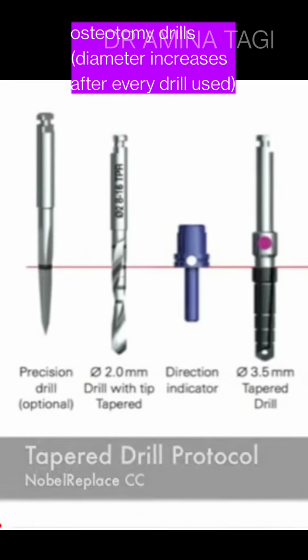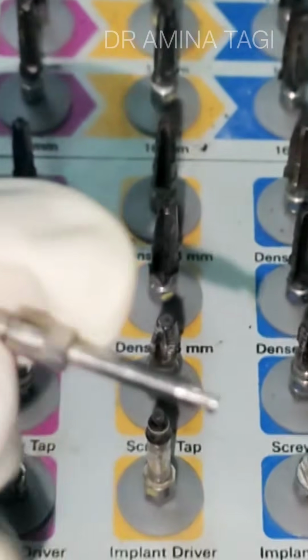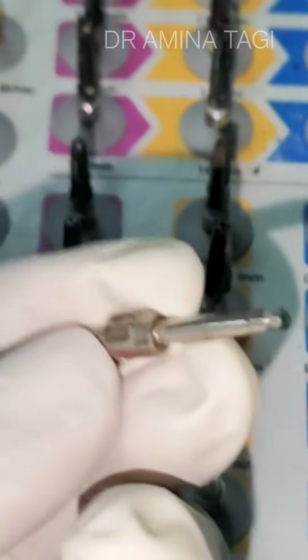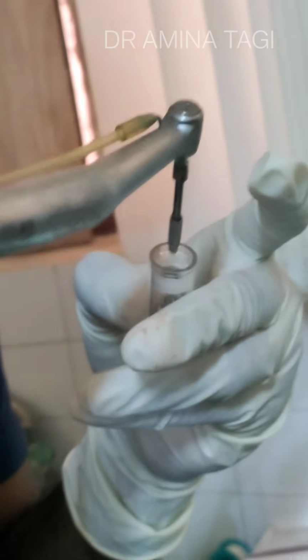So now I am done with the drilling sequence. Now I will be placing the implant finally. So this is the implant driver. We'll insert the implant driver into the handpiece, and then we will take out the implant.